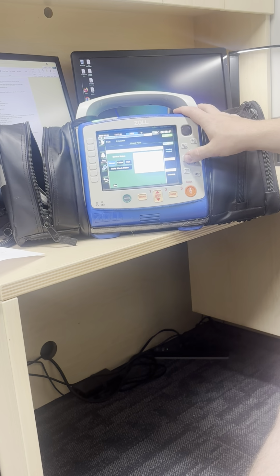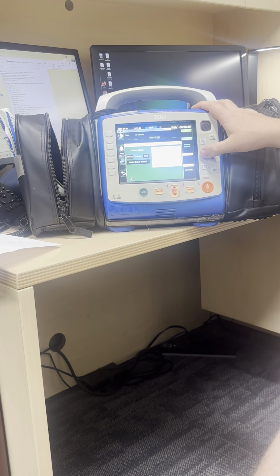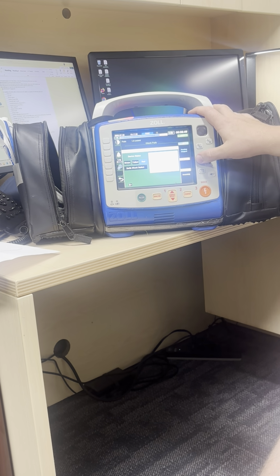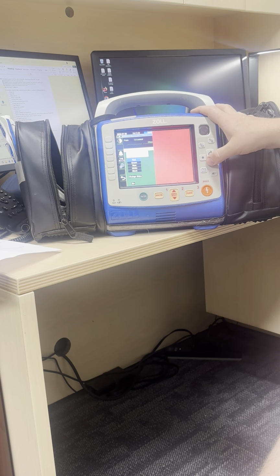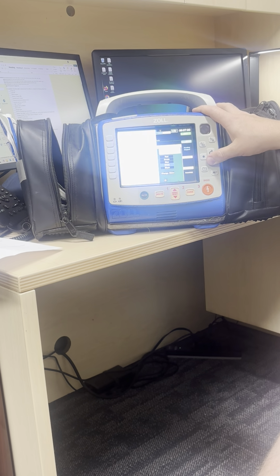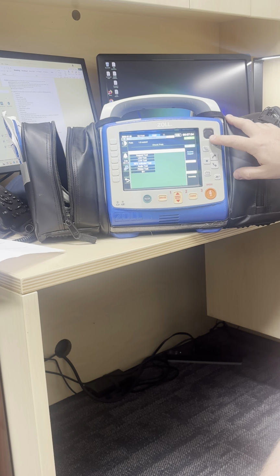The LED test will test the LED status on top of the monitor. Green will flash slow, yellow will flash a bit quicker, red even quicker. And then the defib shock button. The LCD test will test the colors of the screen. The RFU indicator test is this little button here.